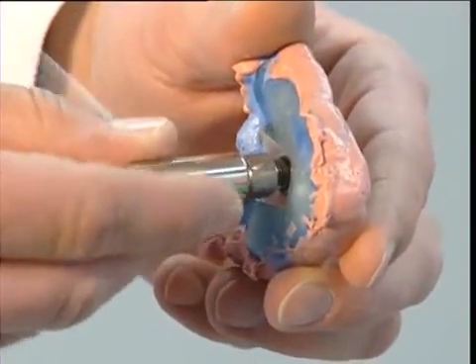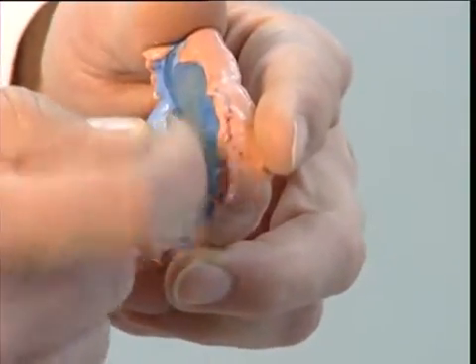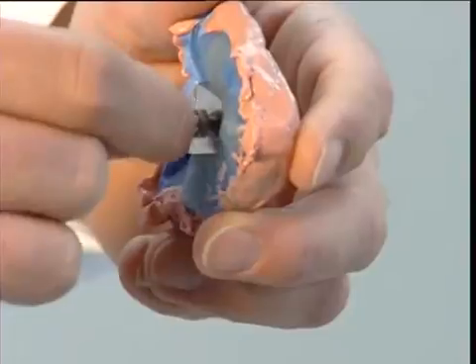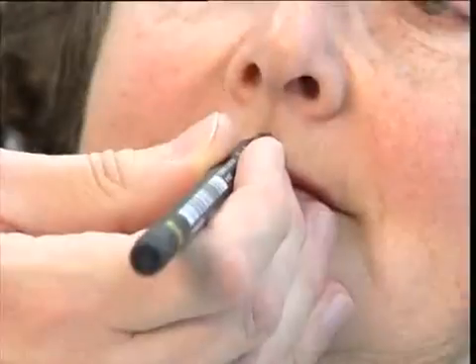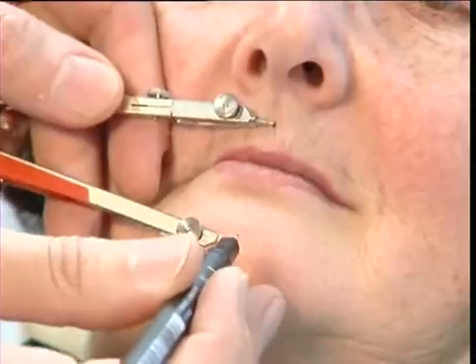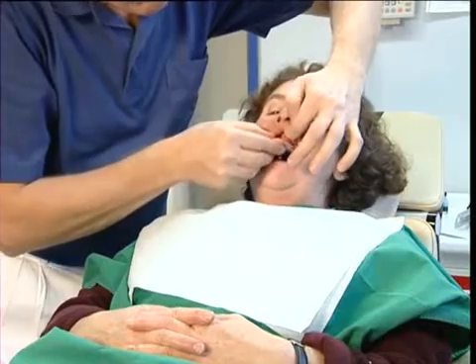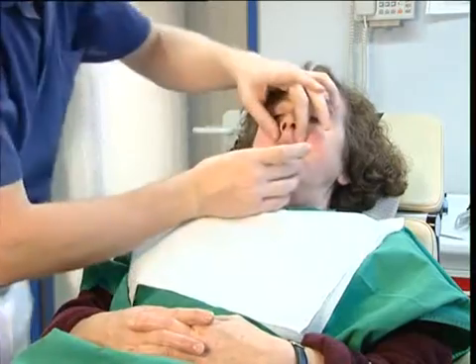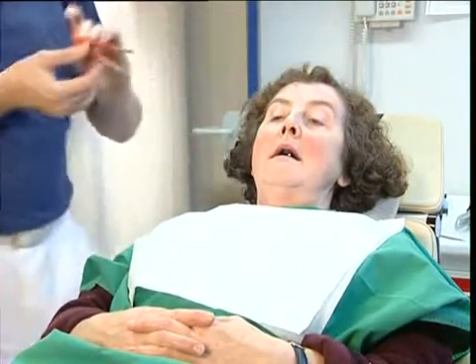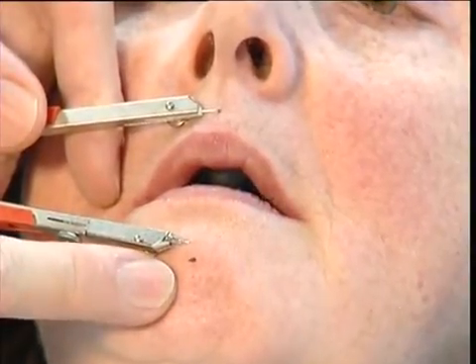The universal wrench is used to loosen the tracing ball lock nut on the upper tray and allow the ball to be rotated for adjusting the vertical dimension. The Artex meter or calipers are used for this procedure. Both trays are placed in the mouth. With the ball and plate in contact, the dentist should check the vertical dimension. In this case, it is much too high.